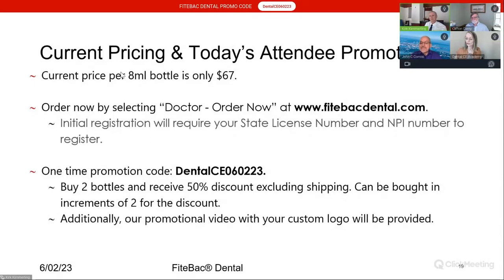Any comment on the use of Tubulicid Red in removing the smear layer? There has been some indication that the Tubulicid Red actually has an effect on the long-term bonding strength. So that's why we don't use that any longer.